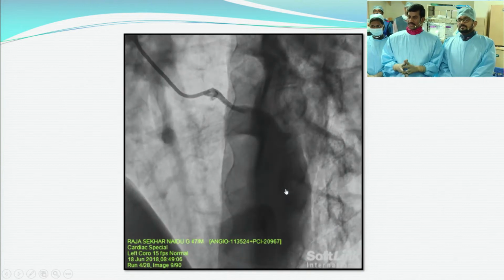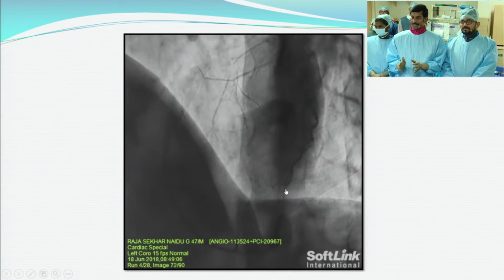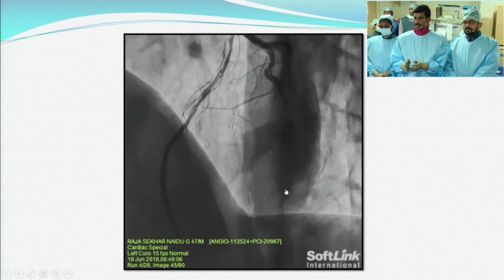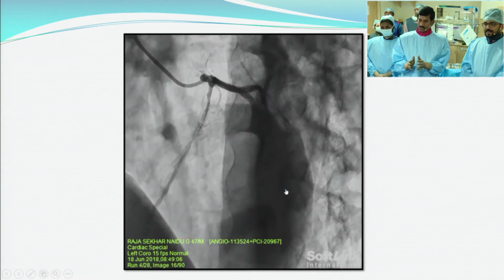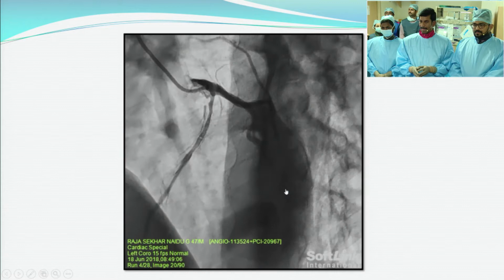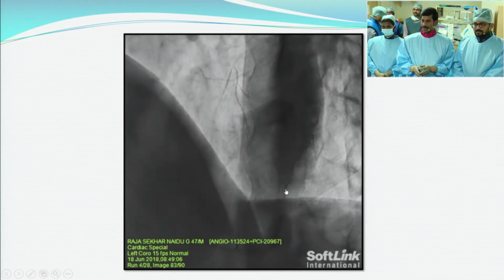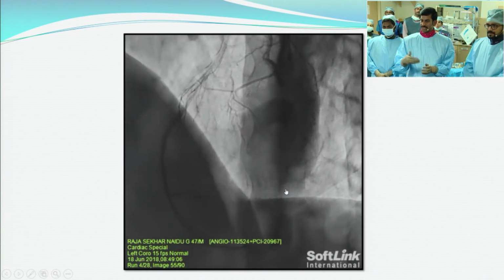You can see that the disease is there well before the stent and after the stent as well. There is a segment of myocardial bridging in the mid segment. But what is important, can you see the radiolucencies, filling defects inside the stent and probably just after the stent? Further reduce it. Yes, we see it clearly. You can probably appreciate that.